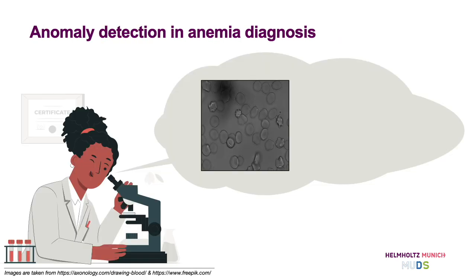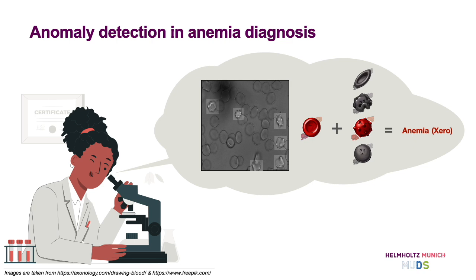In anemia disorder diagnosis, instead of sets, we have microscopic images of blood samples, and cells are instances. Each sample contains a high number of normal cells, and if it belongs to an anemia case, it contains a low ratio of abnormal cells as well. Close monitoring of blood samples in rare anemia patients is crucial for diagnosis, prognosis, and disease severity estimation. However, identifying the low ratio of anemia-relevant cells is a needle in the haystack search and needs to be assisted by automated tools.